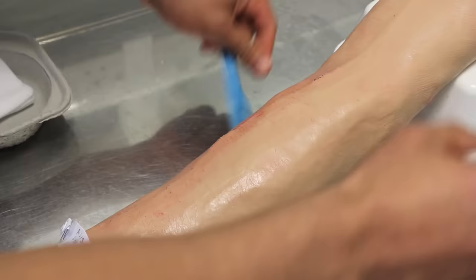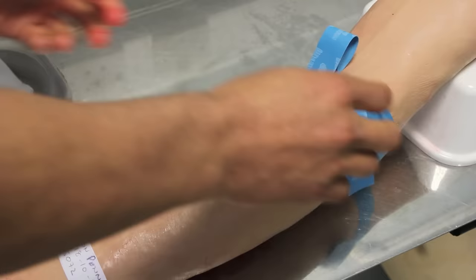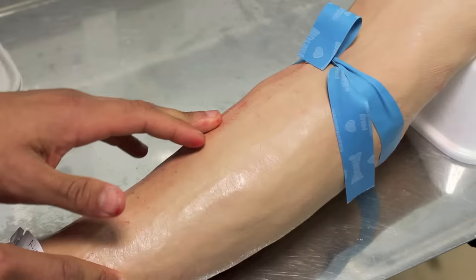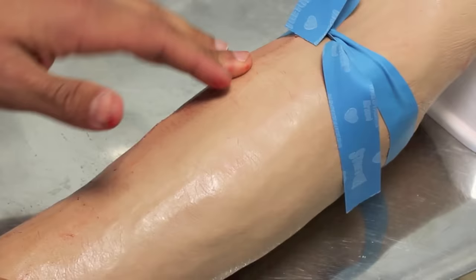Ideally you'll have an apron on for this procedure. I'm now going to put a tourniquet on — tell me if it feels too tight. Does that feel okay? Apply the tourniquet to help you feel the patient's veins. When looking for a vein, it's better to have one that you can feel rather than see. Look for the direction of the vein. Once you've found a suitable one that seems straight and big enough to go into, get the rest of your equipment ready.